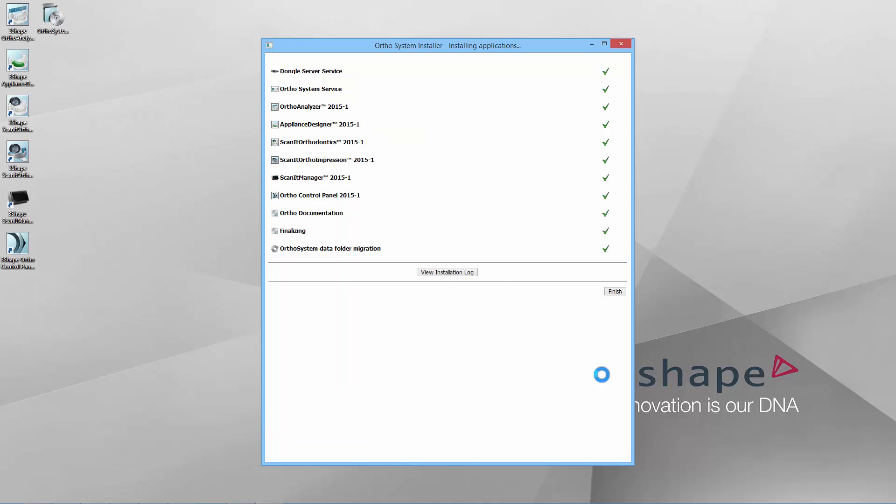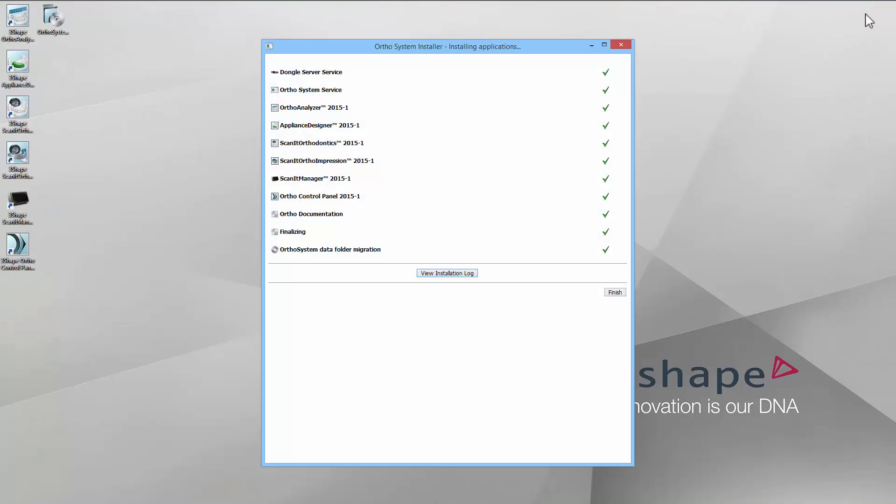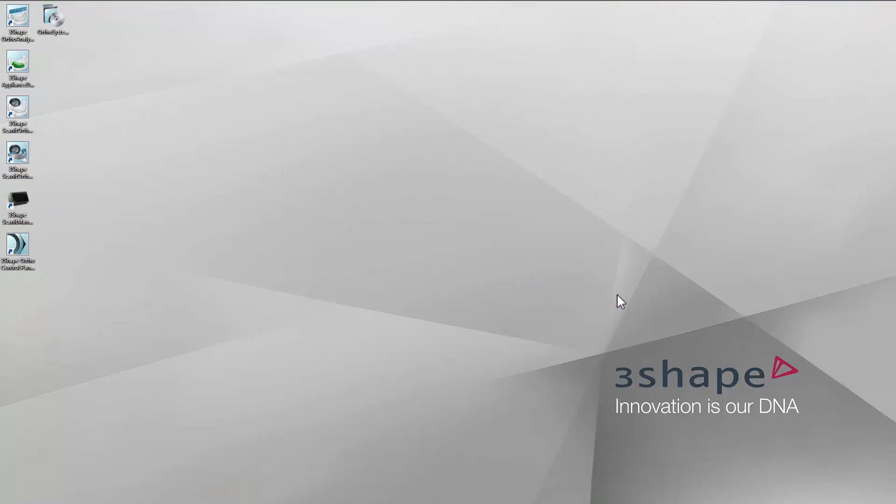When the installation is completed, you may view the logs. In order to do that, please click the View Installation Logs button. The logs will show in the new pop-up tab of your internet browser. When you finish reading them, close the window and click the Finish button. Congratulations, you have installed the OrthoSystem server.